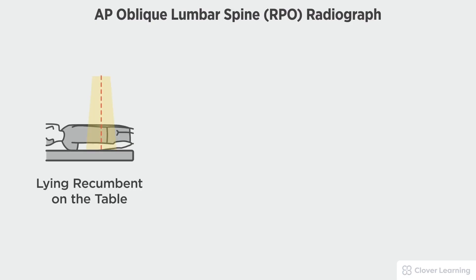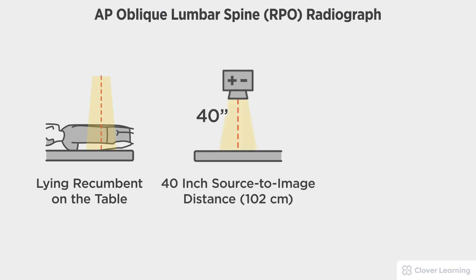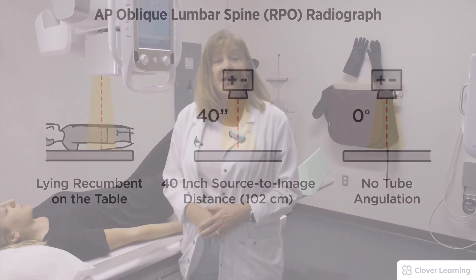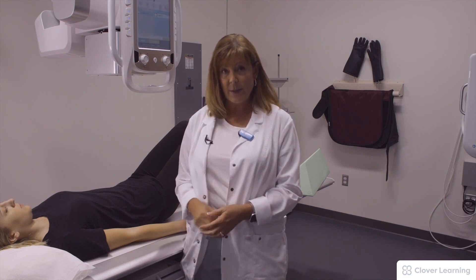In this view we will be demonstrating the AP lumbar spine right posterior oblique. The RPO view should be performed with the patient lying on the table with a 40 inch source to image distance and no tube angulation. The patient will roll towards me 45 degrees.